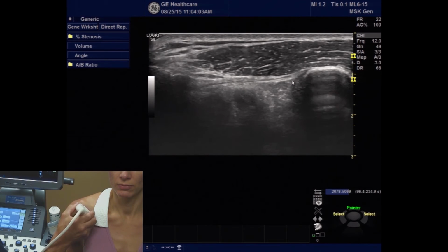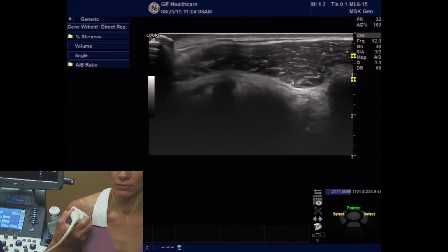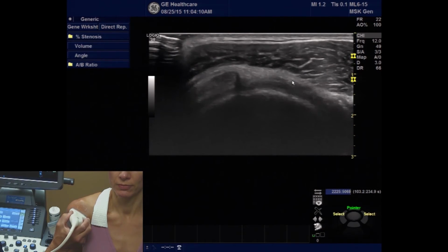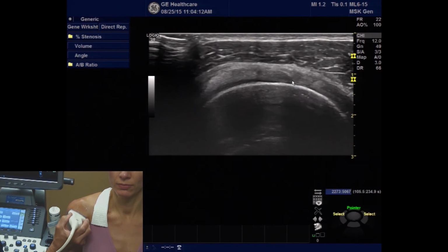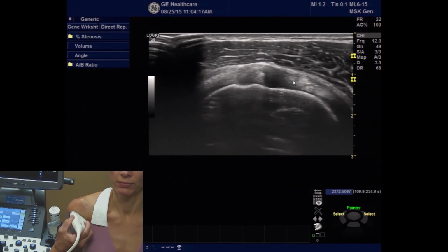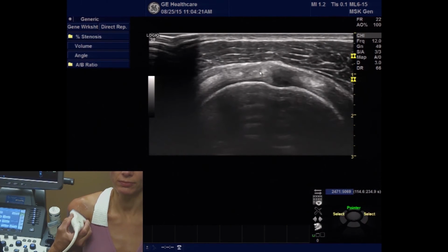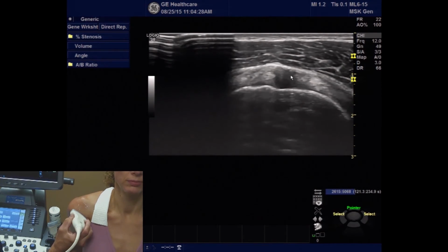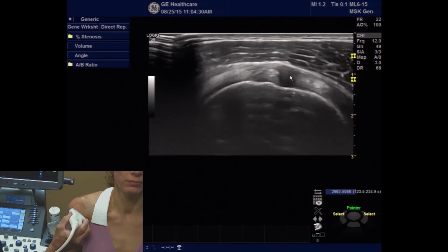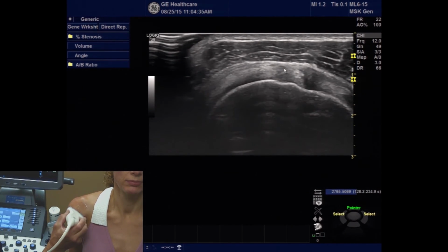And I'm going to start sliding the transducer inferiorly. So I will be getting a short axis view of the tendon, muscle, tendon structure. And this is where we're going to be able to see the biceps tendon in its short axis, which will indicate that medial to that will be the area of the subscapularis tendon, and out a little bit laterally and posterior will be the supraspinatus tendon.